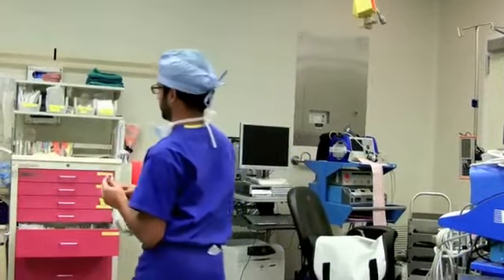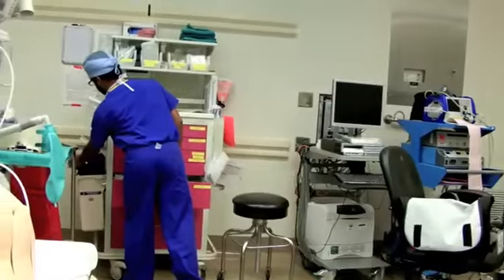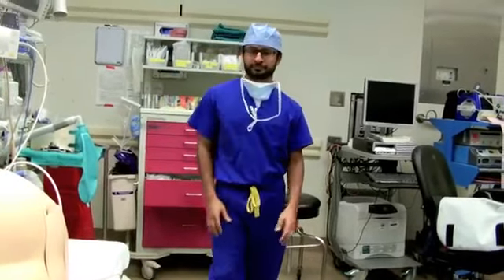After laying your patient on the side and vitals being stable, make sure to throw away all your sharps into a sharps container. That's the conclusion of the teaching module checklist for performing spinal anesthesia.